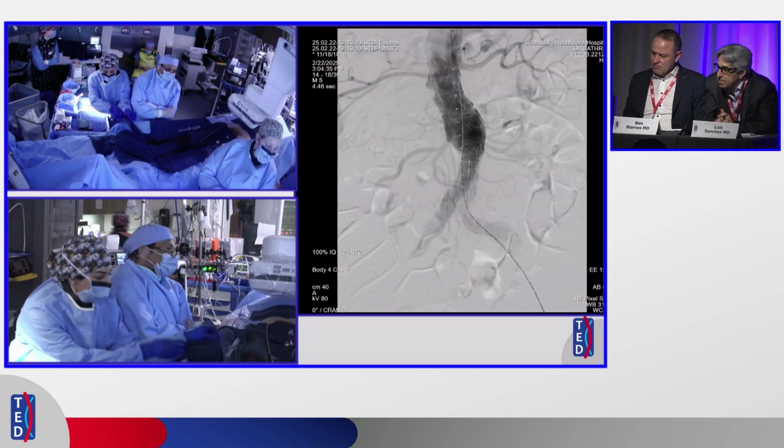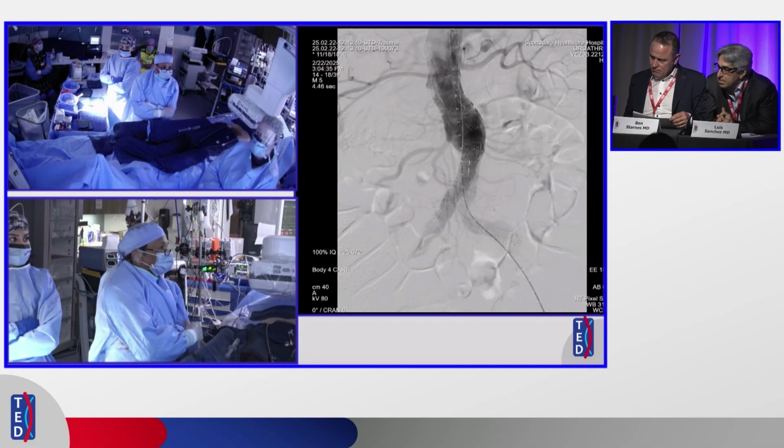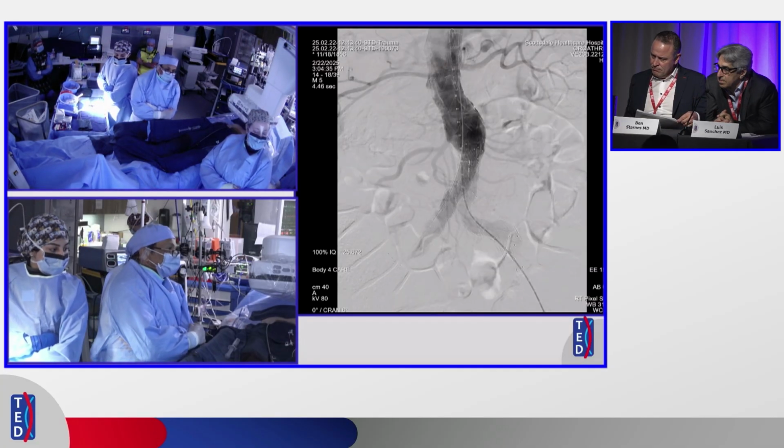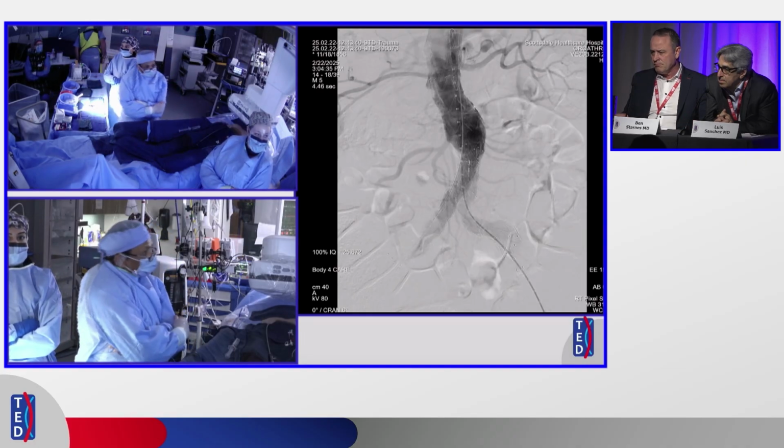Venki, I don't know whether I can make this a comment. Hey, Venki, Cassie, what's up? I hate to leave the OR with a type 1 endoleak, so this may be a patient where the endoanchor, if you can get rid of it, may be a good option for this patient.